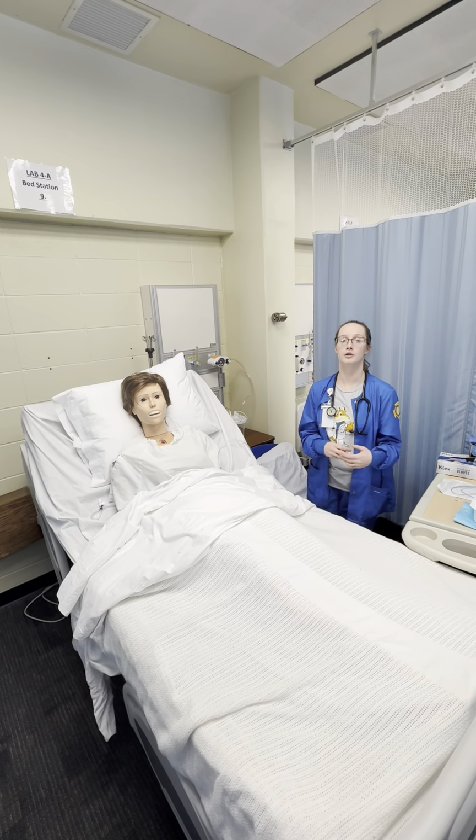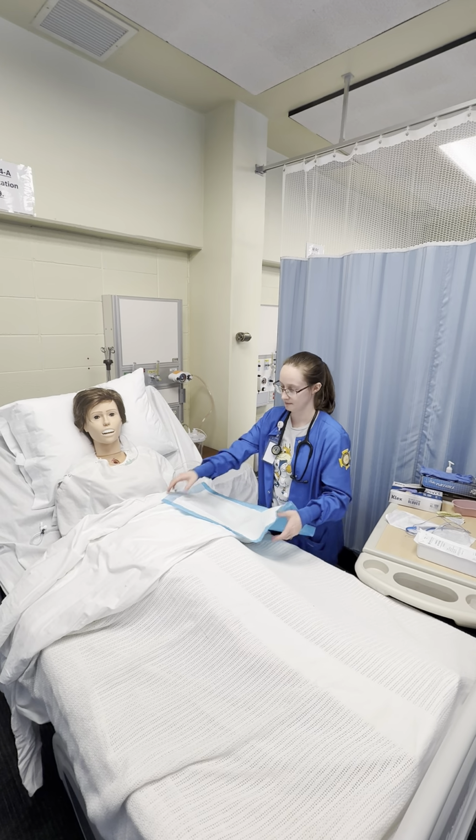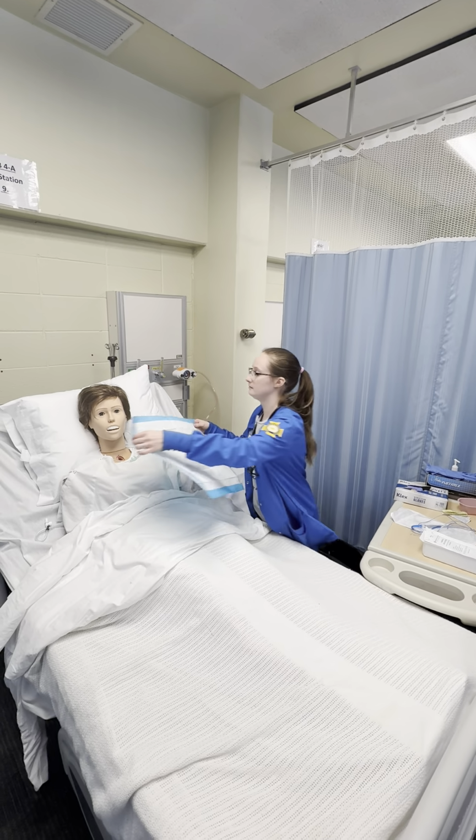I want to put a towel or disposable chuck across their chest. I also want to make sure that there is an emesis basin and a box of tissues within reach.